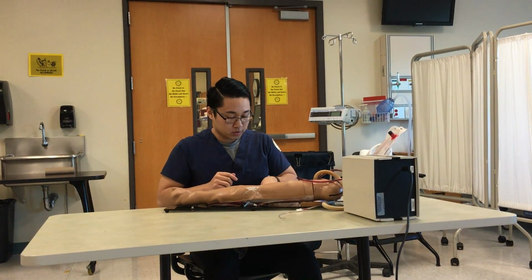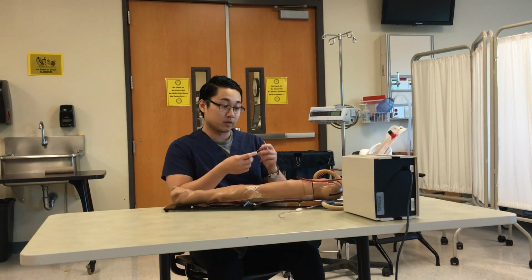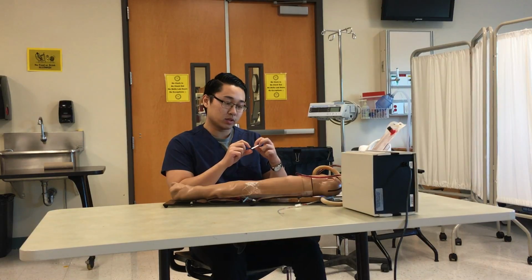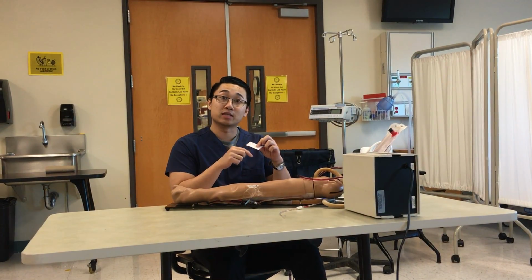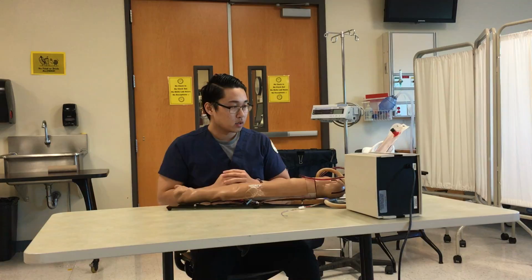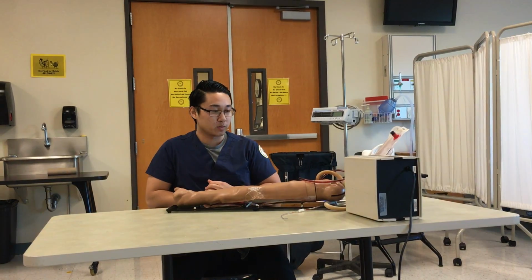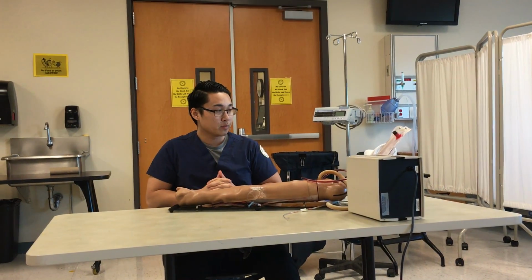Alright, now I'm going to fill out my requisition slip. I'm going to have the name, the temperature, the room number of the patient, the date, the time, and the FiO2 settings, and the device as well. Now I will go into the room, knock on the door, introduce myself to the patient. Hi, I'm Brian. I'm from the respiratory department. I'm here to take an arterial blood gas sample.